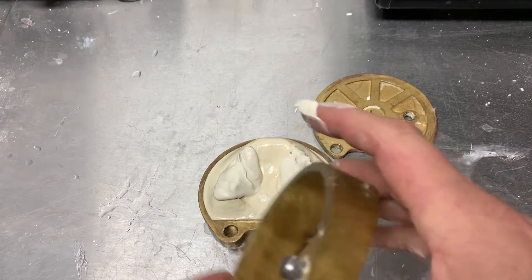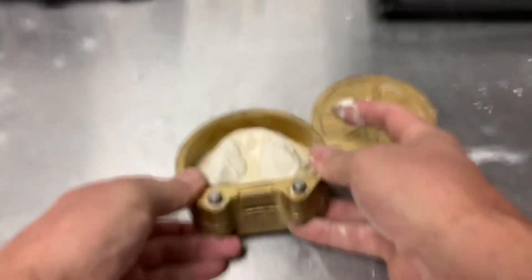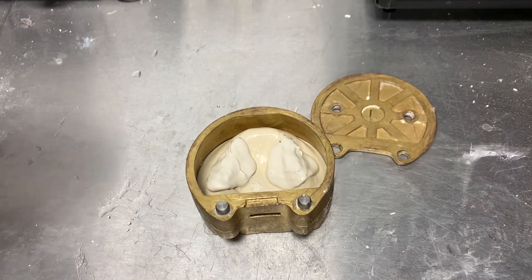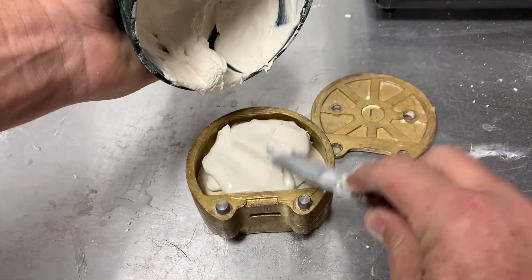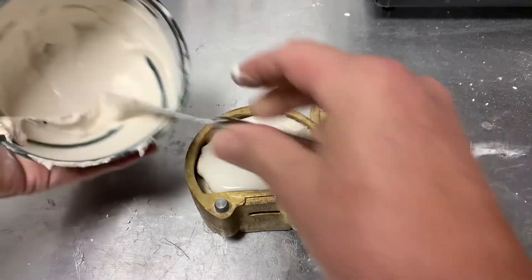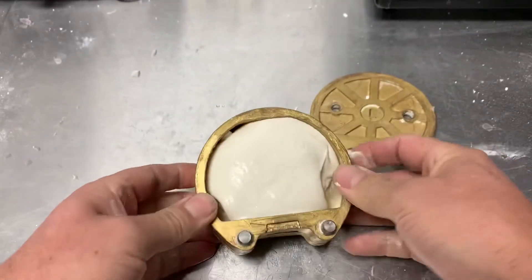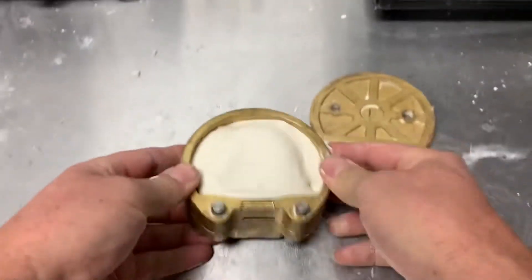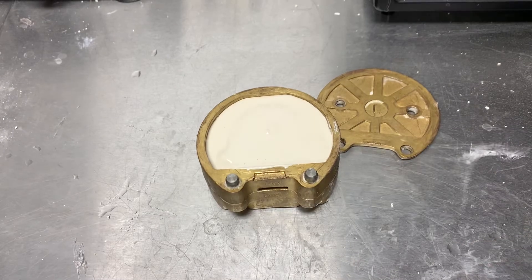I've ensured that there are no air bubbles between the two layers, and I'm going to cover up to the tops of the teeth. You can let that set and then put a third layer if you wish.